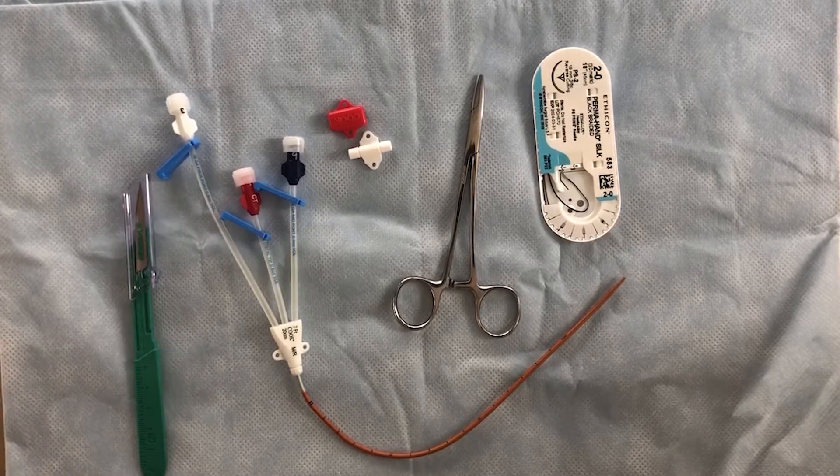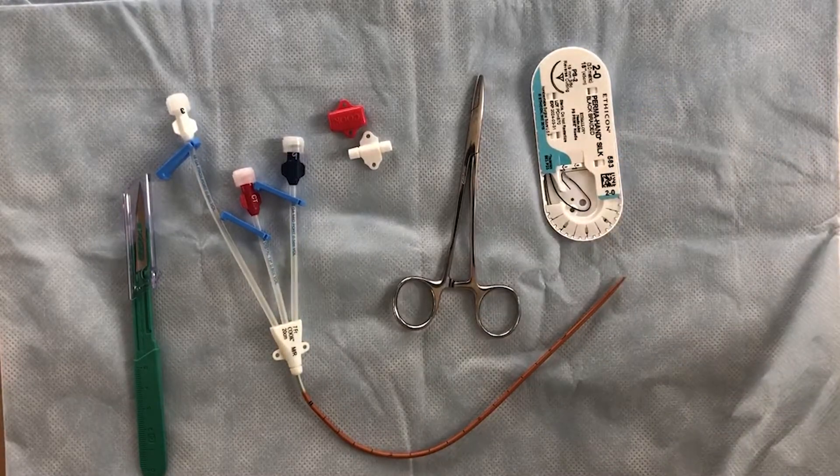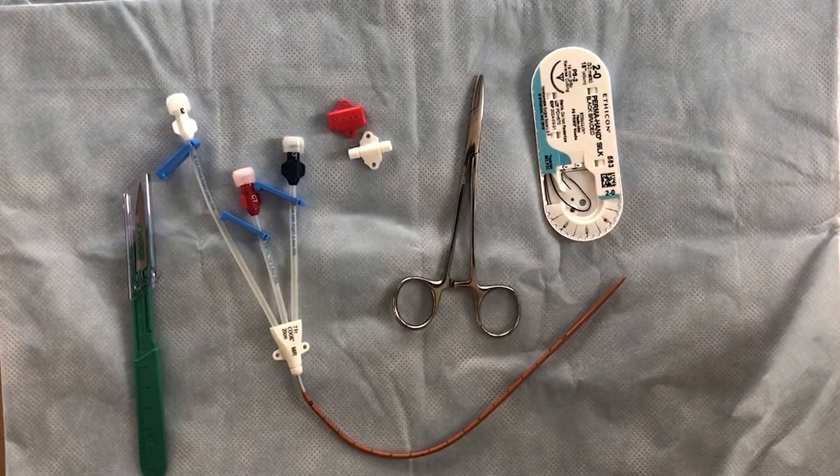So we have the catheter scalpel, we have a suture material with a curved needle in this case, so since it is a curved needle I do have a needle driver. You can also get your hands on a straight needle if you want to do it by hand — some people prefer that, and that's perfectly acceptable.